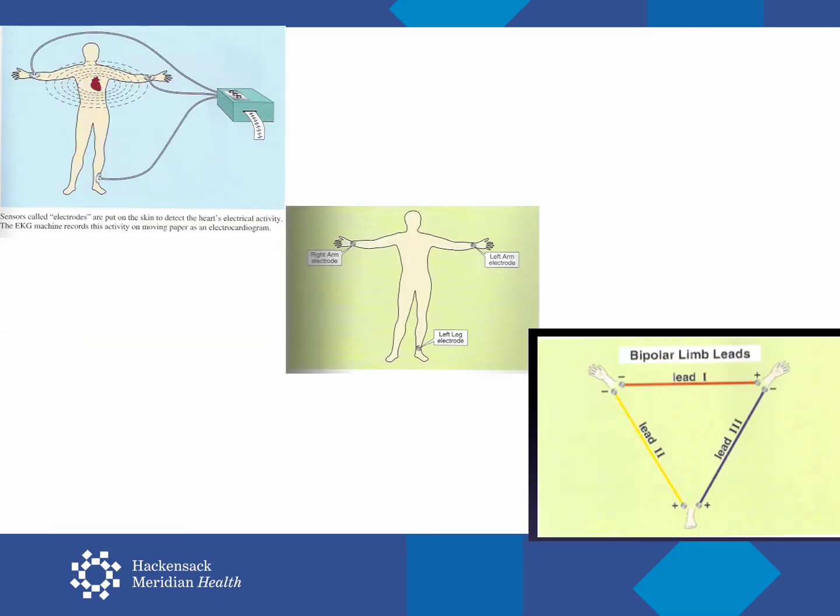And of course, you'll recall that the leads of the standard EKG are arranged in two planes. The first is if you were facing the body from the front and tells you whether the direction of the charge is to the right or the left, towards the head or the feet. These are called the limb leads.